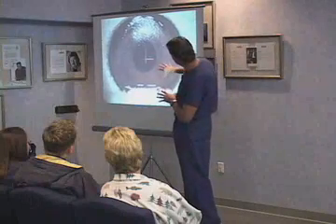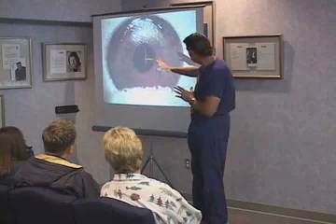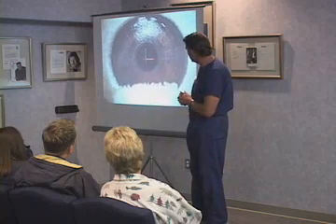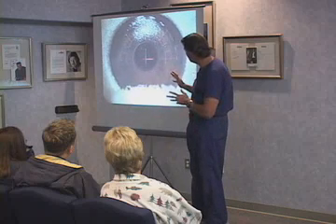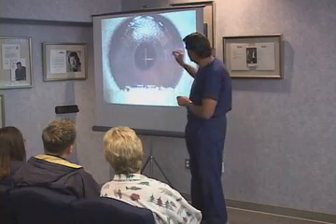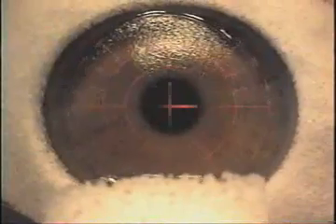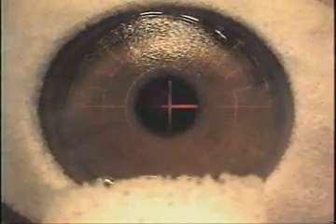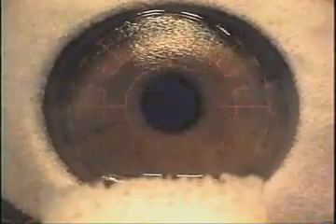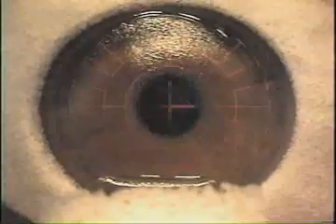Now, I'm going to get him centered, and I'm going to lock onto him with the tracker. When I lock on, you'll be able to tell because the blinking cross in the center, the crosshairs will stop blinking. He's locked. Okay. Now, what you'll see, you can't see the laser because the beam's invisible, but you can see the reflection of it, and it'll begin pulsing at 8 pulses a second in the center, 7 rotating beams as soon as I'm happy with where he's at. I'm just yakking with him. Now we started, okay? You can actually see the reflection of the beams. They're pulsing 8 times a second. It's rotating like this, and it's moving out gradually and slowly.